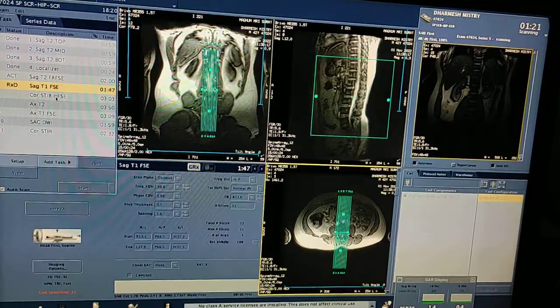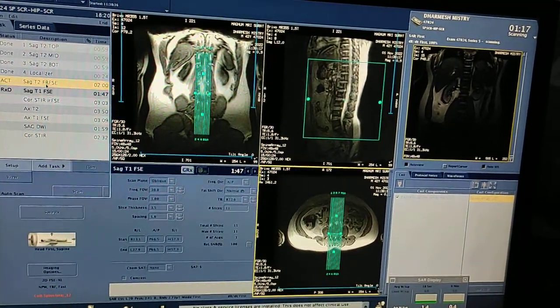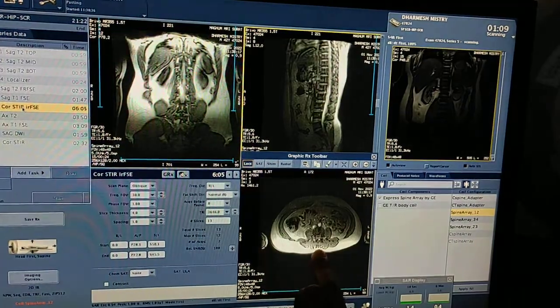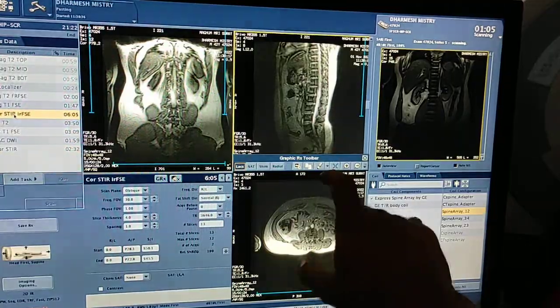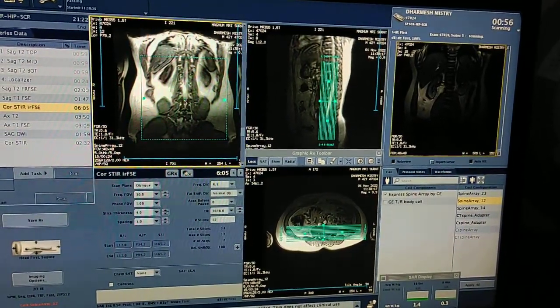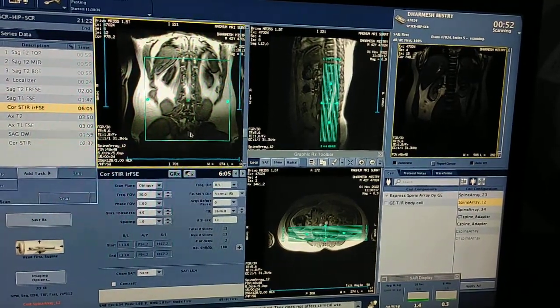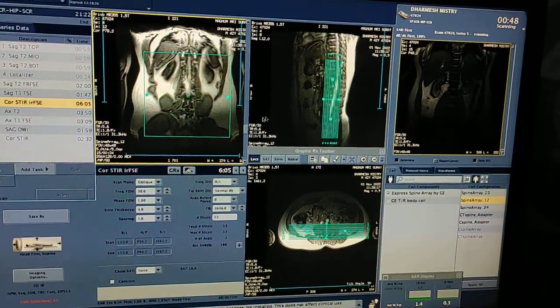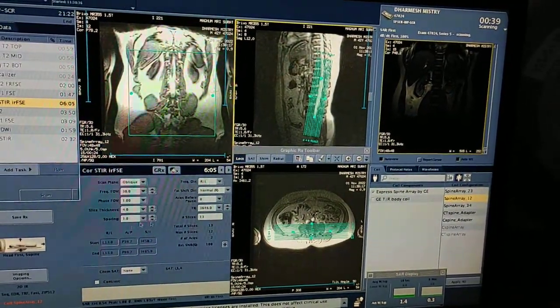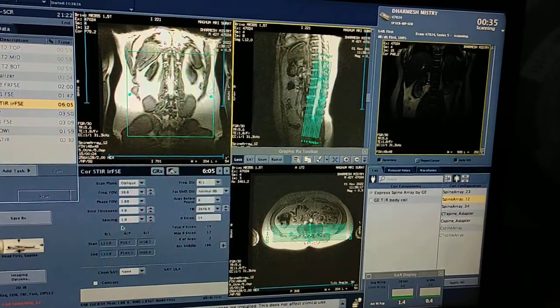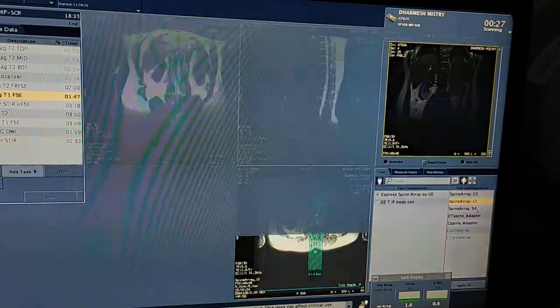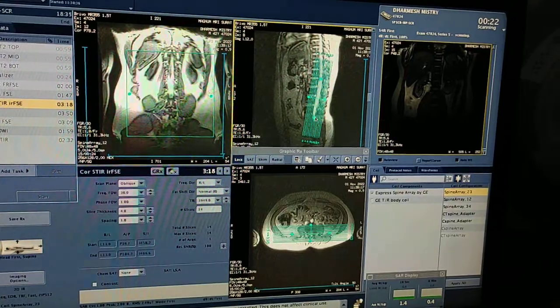Now plan Coronal STIR. Double-click and open it. For coronal, you plan on sagittal and axial — but for all spine sequences in lumbar spine, plan coronal on the sagittal image. Click on sagittal and adjust the box of the coronal, slightly oblique along the spinal cord to cover the region. I take 13 to 14 images; spacing is 1 and thickness is 4. Save Rx.